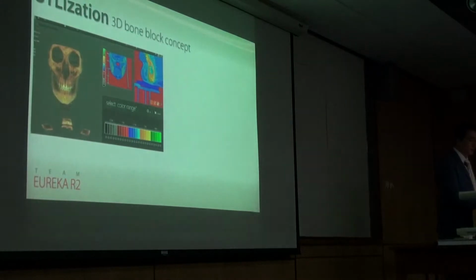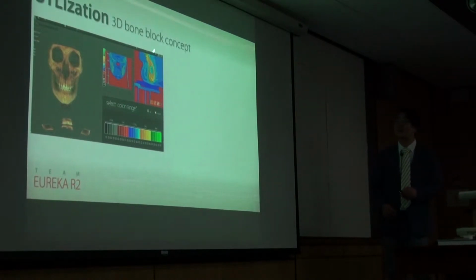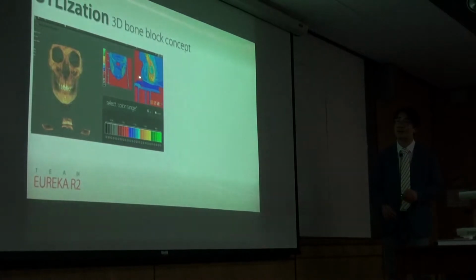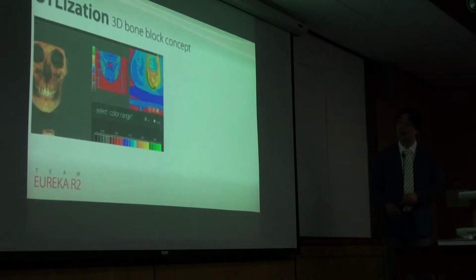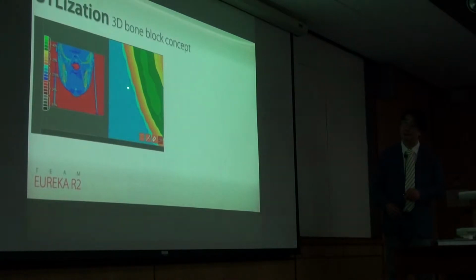My job is always to find the digital DNA. As I mentioned before, this is the color code system. So can you see this image? Where is the bone boundary? Okay, I zoom in. What color is the bone boundary? Yellow, dim yellow is the bone boundary, right?